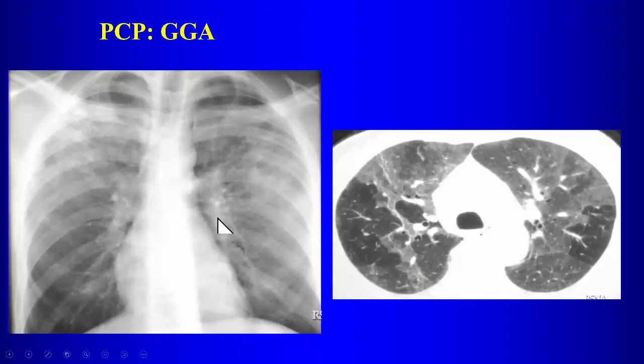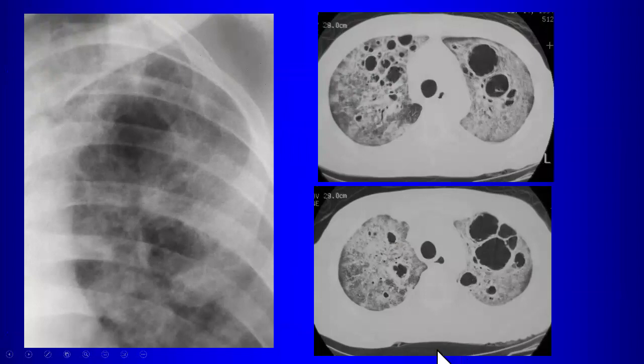Now sometimes you may have a patient who's short of breath in the emergency room, they get a CT scan, PE scan, right? And you notice these ground glass opacities on your PE scan. You might think it's pulmonary edema, look for interlobular septal thickening, pleural effusions, etc. But if you see this in a young patient, they may not have done an HIV test yet, right? So you might be the first one to suggest that maybe this patient has pneumocystis pneumonia, and that they should test the patient for HIV.